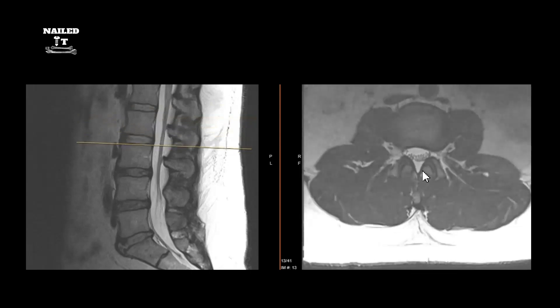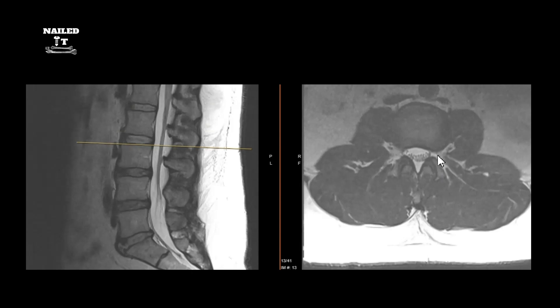Looking at the axial anatomy: you have nerve roots in the thecal sac surrounded by CSF, then your facet joints — the articulating portion of the posterior spine — consisting of inferior and superior facets. These make up part of the borders of the foramen. The regions are: central canal, lateral recess, foramen, and then far lateral as you go outward.